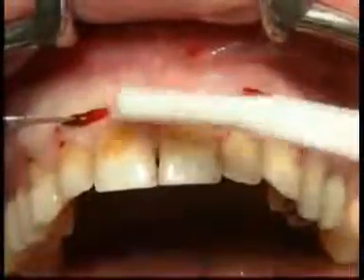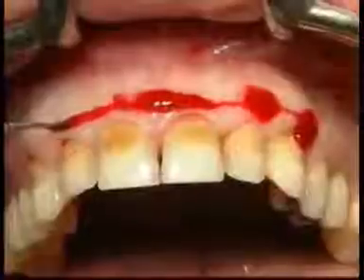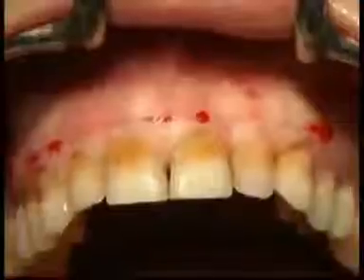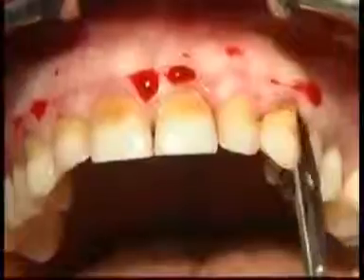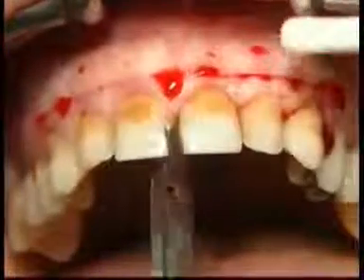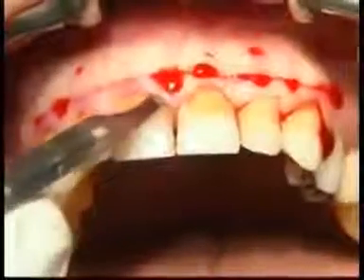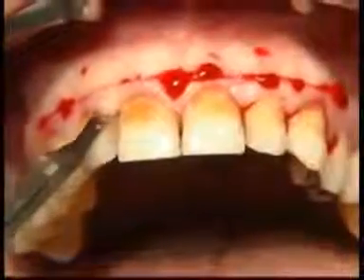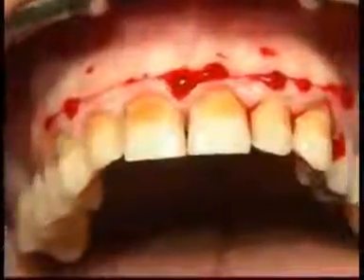Once this horizontal incision has been terminated, a new incision is made within the sulcus, which, if it has been carried out correctly, will reach the first horizontal incision, and so a secondary flap can be lifted, and its simple removal will be directly proportional to the quality of the incision previously carried out. If these incisions have been made in an optimal way, it will be possible to easily remove the whole flap.